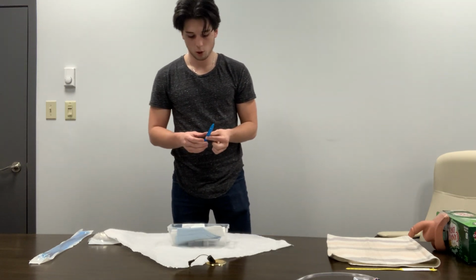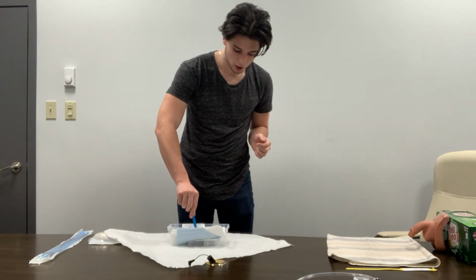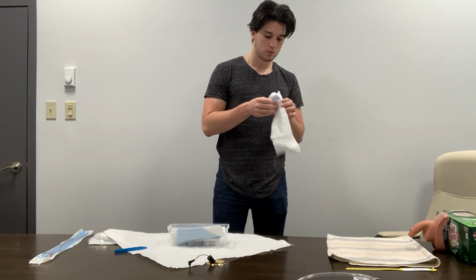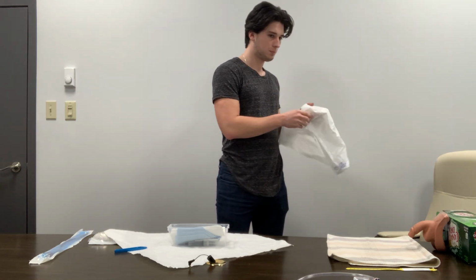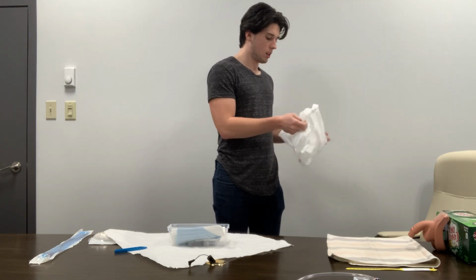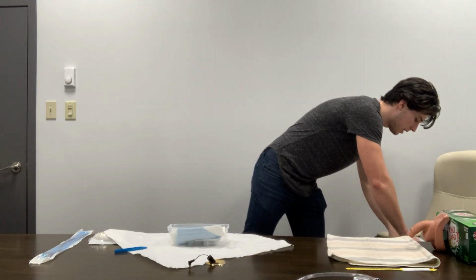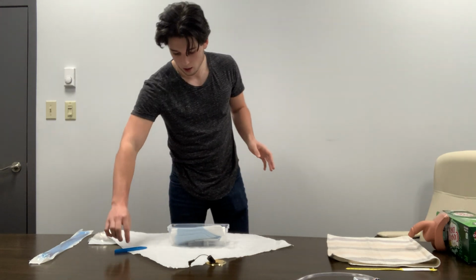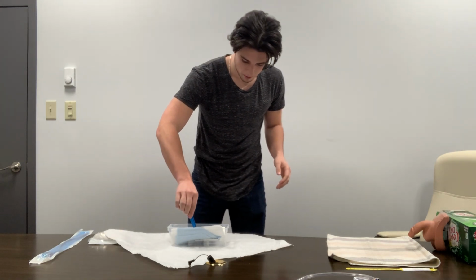So once our sterile field is open, we can go ahead and start right away and grab our garbage bag out, and then place our forceps down. So we can grab our garbage bag here, and we'll set it up on the side here. And now that we have that set up, we can go ahead and grab our first drape here.